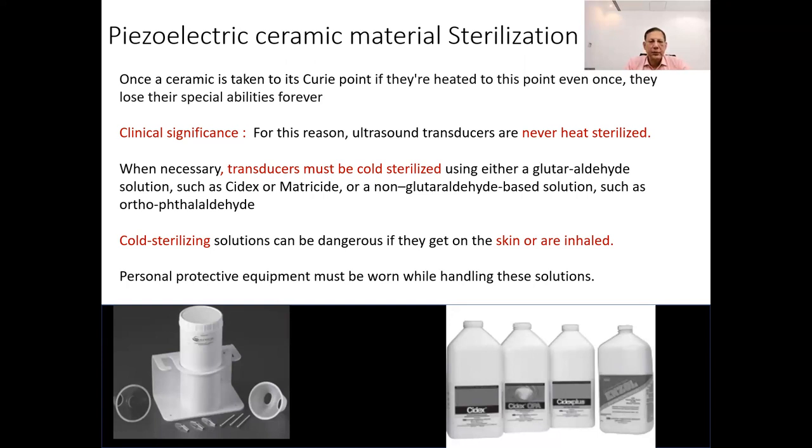In summary, because ceramic materials used in ultrasound transducers can't handle heat sterilization, they must undergo cold sterilization instead, but handling the sterilizing solutions requires caution and protective equipment to ensure safety.